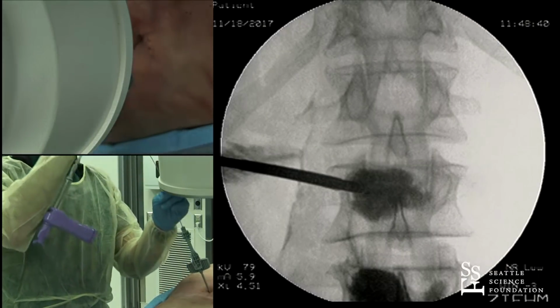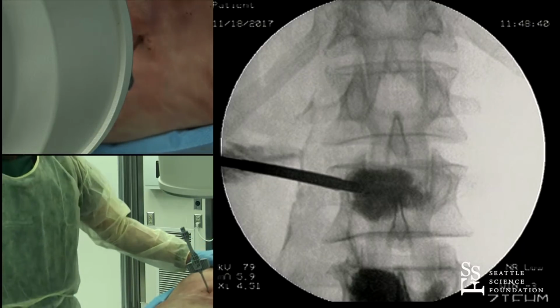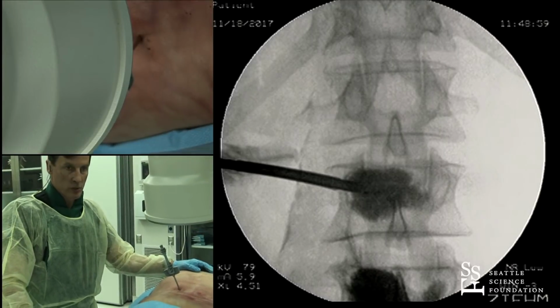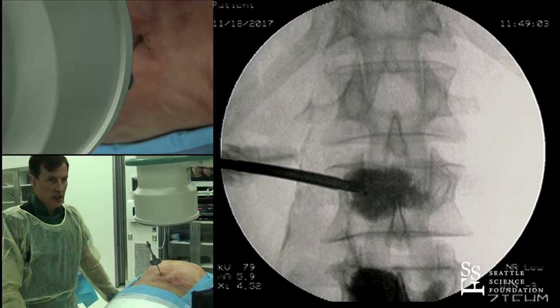It had almost significantly fewer adjacent-level fractures. It had significantly fewer adverse events, and overall it was every bit as good as balloon kyphoplasty. So there we go. I mean, that's it for the Kiva device.